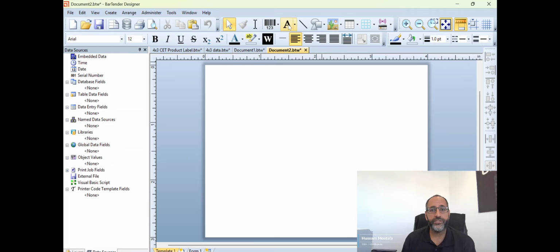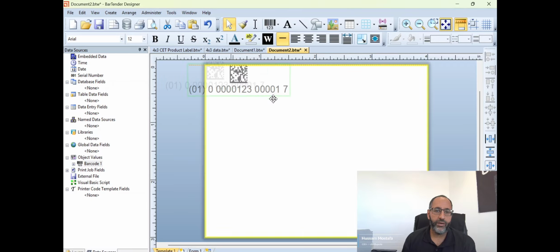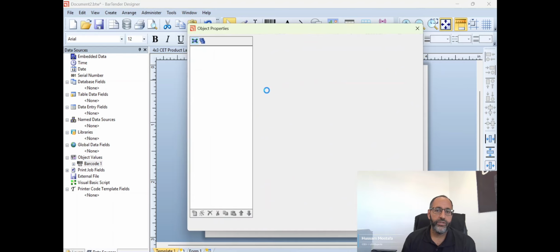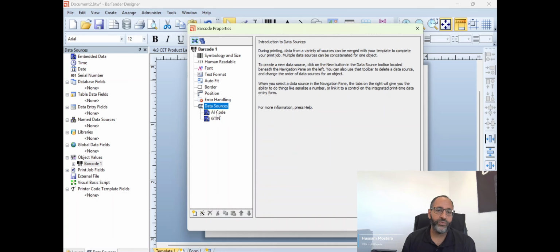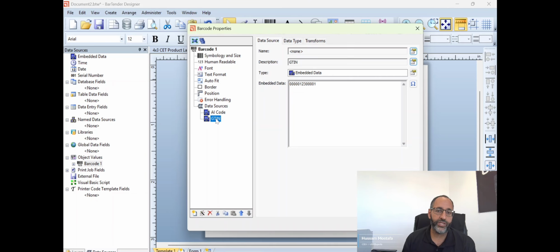And now we can go ahead and enter the 2D data matrix barcode. So I'm going to click on this barcode right here, and we'll choose the GS1 data matrix. I'll just click here and put in the 2D data matrix. Now, in order to change this one to add our global trade item number and production identifiers, we'll go ahead and click on data sources. As we see, we have AI, which stands for application identifier code for the global trade item number. So that's already in there. We have some data in there already. This 14-digit global trade item number is there, which is fine.